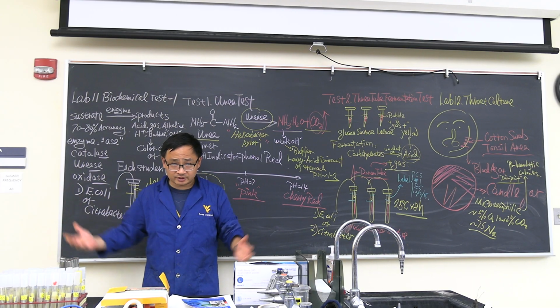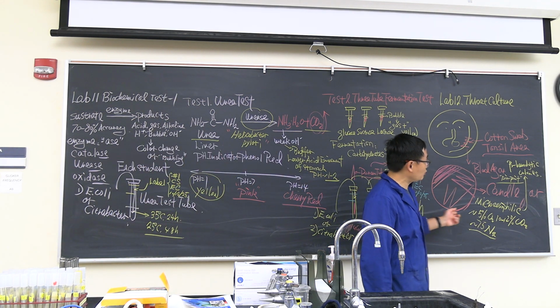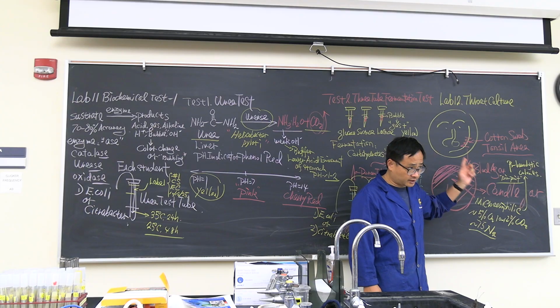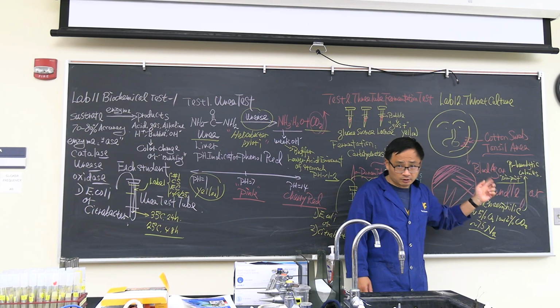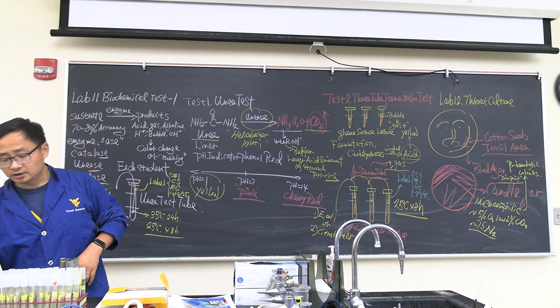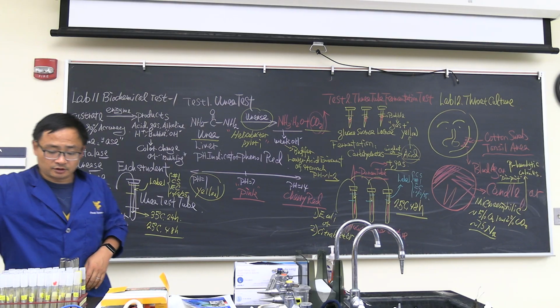And then we do the Gram stain, you will see a beautiful morphology and arrangement, and that's from your own culture. That's the reason why I wanted to do it today, because it certainly helps you review exam 2 and get hands-on clinical experience. I used to move it very late, like in November, but I think you have an exam to prepare, so we're going to do it today.